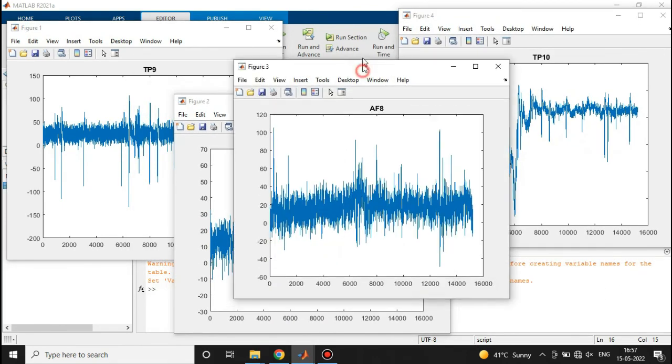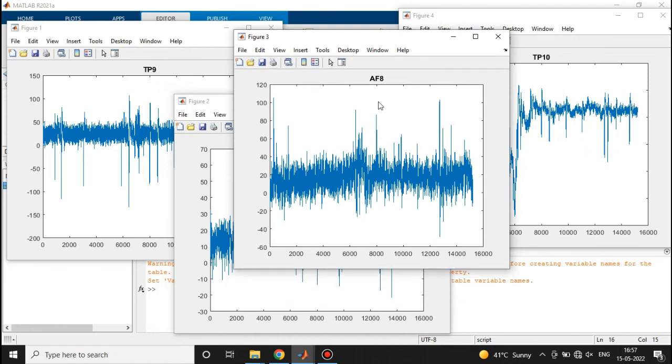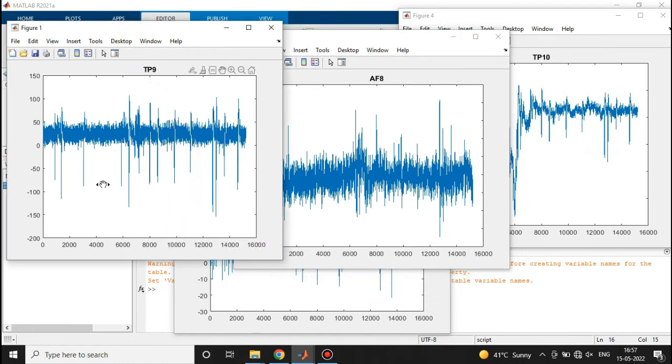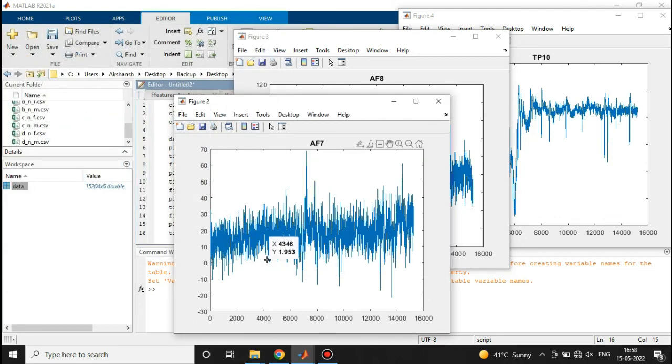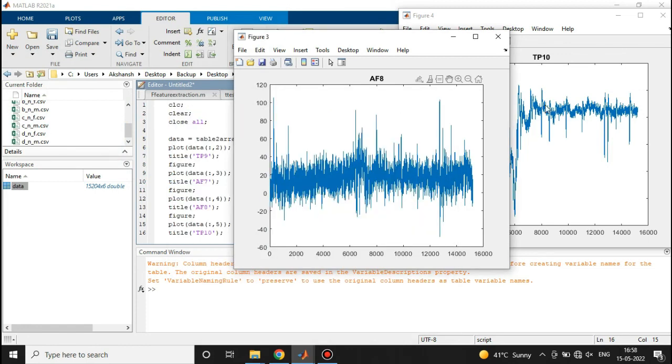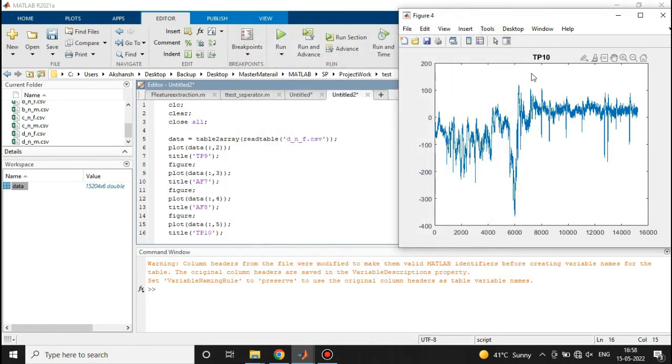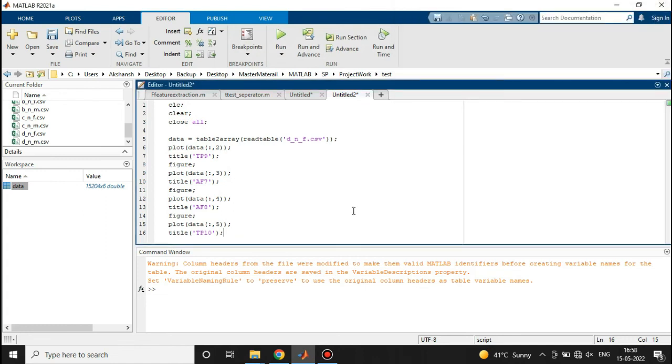Okay, so now here you can see that at TP9 location we had a signal something like this, at AF7 location we have a signal something like this, and for AF8 and at TP10 we have a signal something like this. So this is how we plot the EEG signal into MATLAB. In the next tutorial we will do some amazing things on the EEG signal, so stay tuned for that.